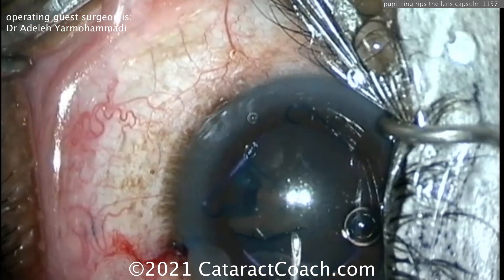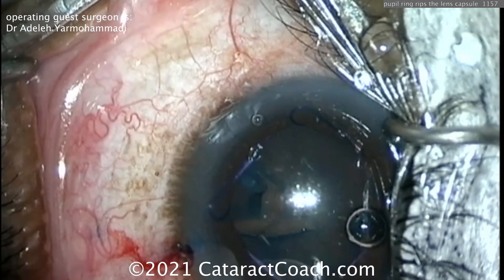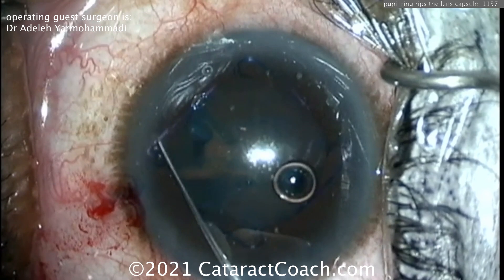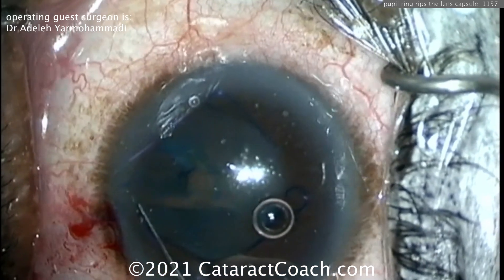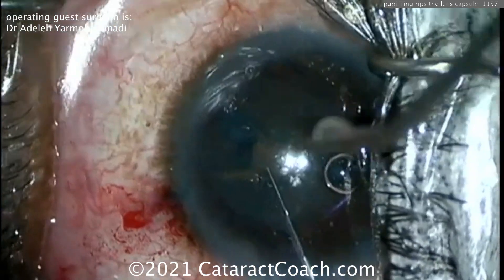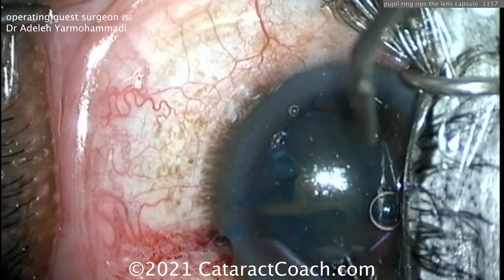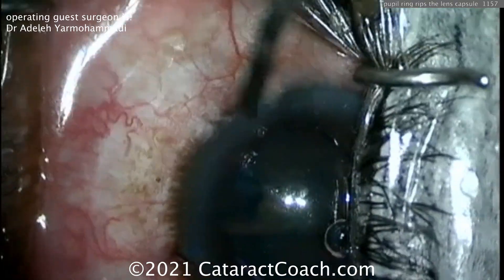Still trying the same thing — if you try it more than three times and it's not working, move on and try something different. In the old days without these videos you had to learn just by doing; now you can learn from cases like this. I like this idea of pushing the ring around to see how far the tear has radialized — it does look like it's ripped out pretty far. We still need to finish opening the capsule, and if there are weak edges we need to convert them into a curvilinear shape.